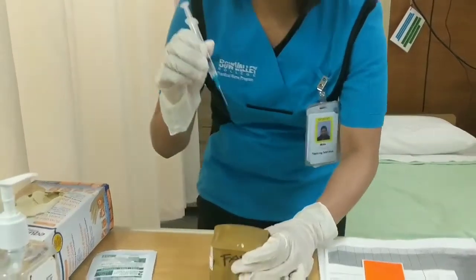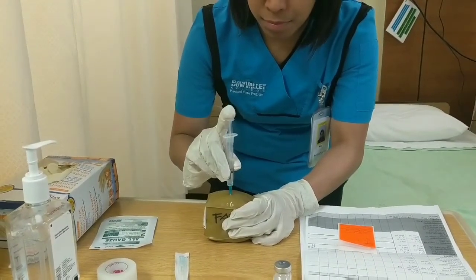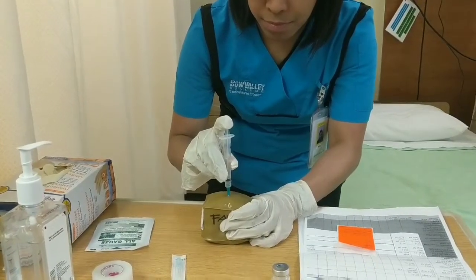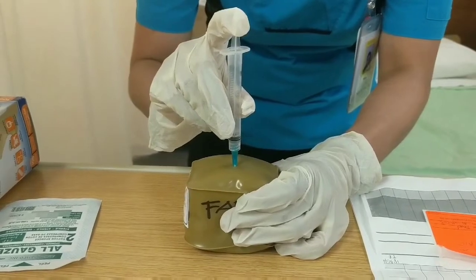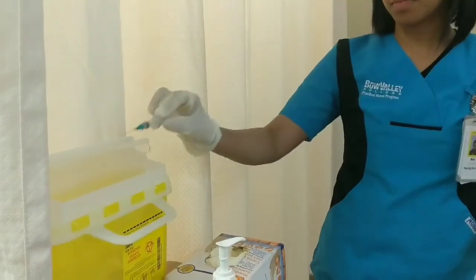Pinch an inch. Inject the medication at 1 ml per 10 seconds and hold it for another 10 seconds for proper absorption, and throw the needle into the sharps.